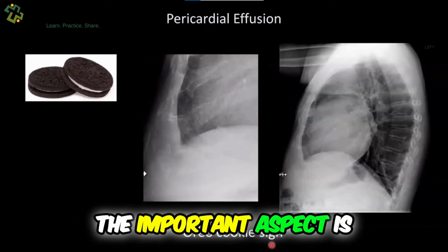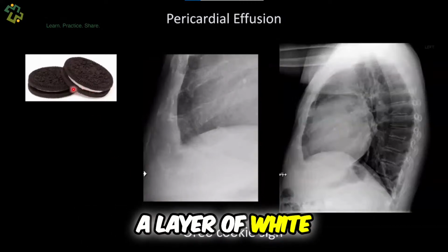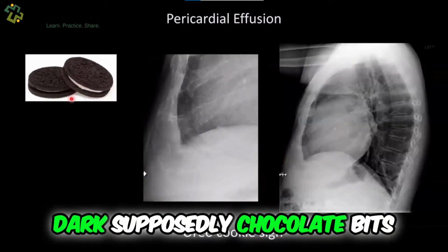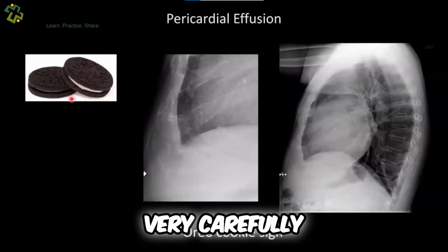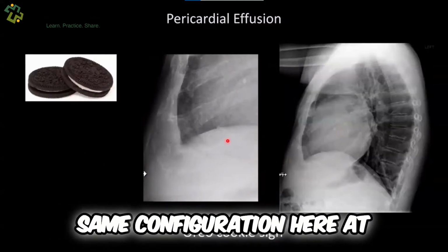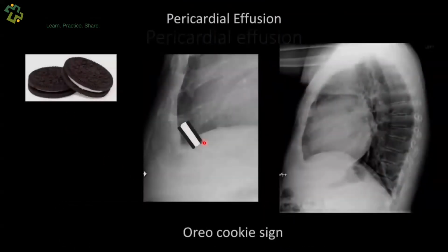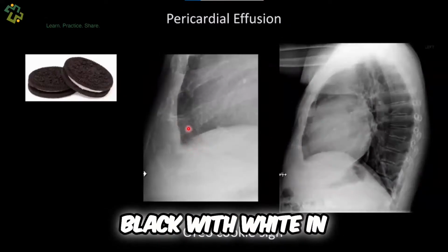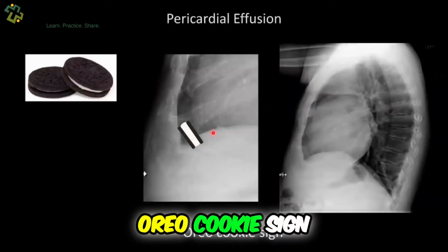The important aspect is that it consists of a layer of white cream, which is sandwiched between two dark, supposedly chocolate biscuits. Now, if you look very carefully, you can see the same configuration here at the front of the heart. Look at that. Can you see it? Black with white in the middle. Boom, Oreo cookie sign.